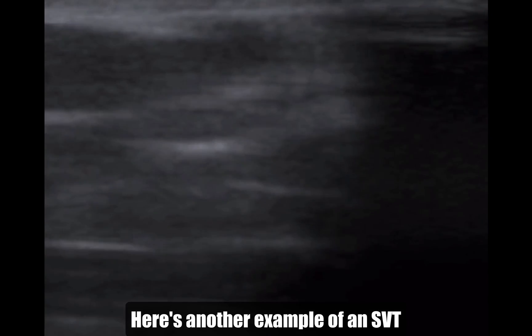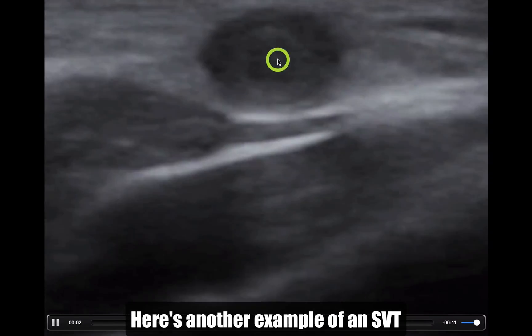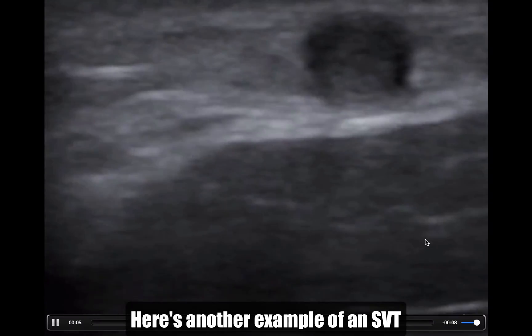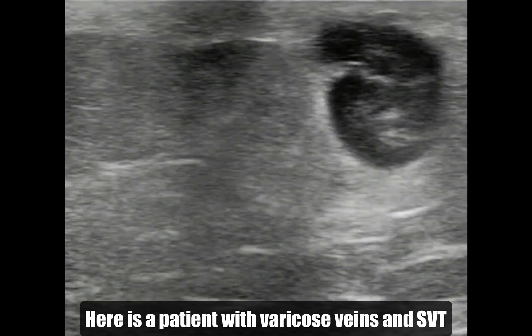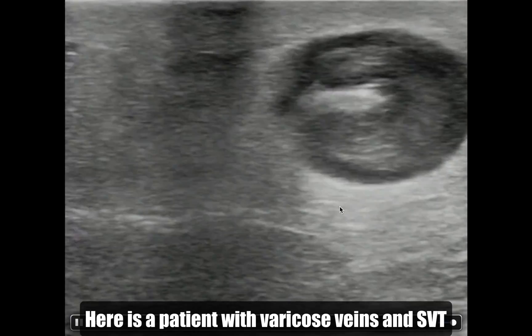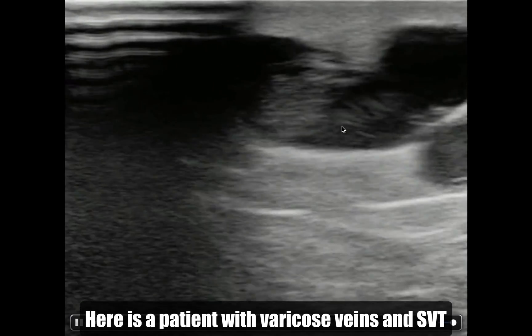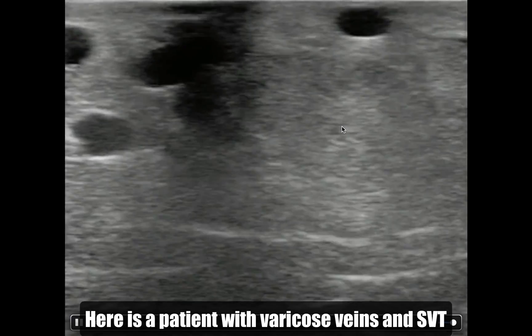Here's another example. You can see a little bit of echogenic material in this vein, and it's non-collapsible. It's really that easy. And here you have a patient with varicose veins — you can see there's clot in this varicose vein over a very long distance.